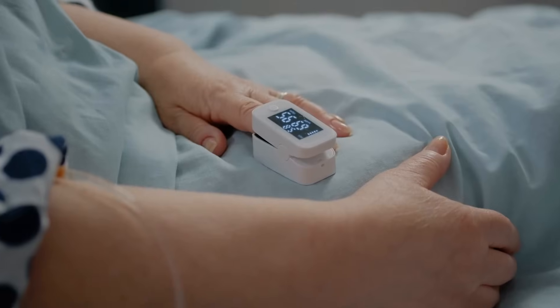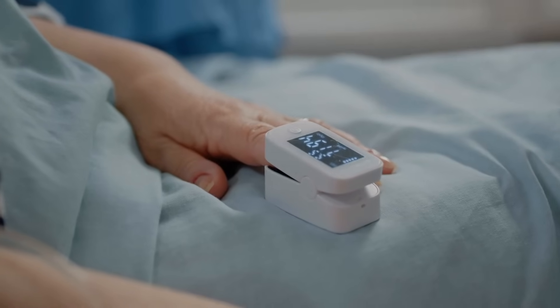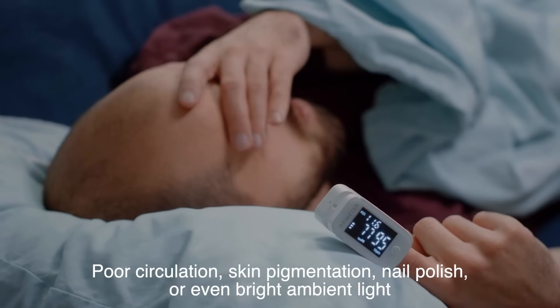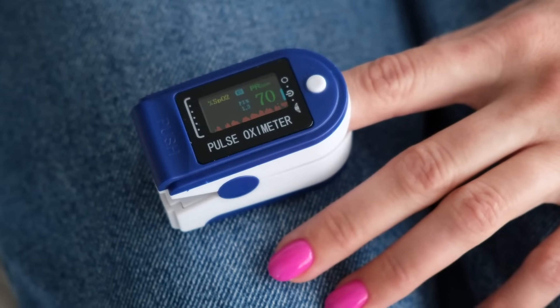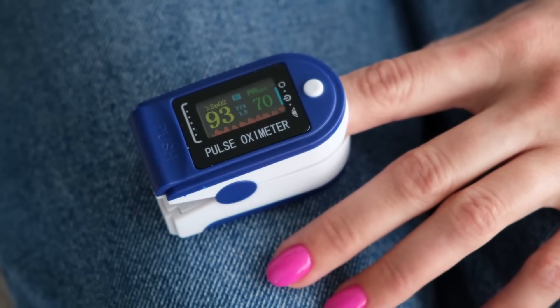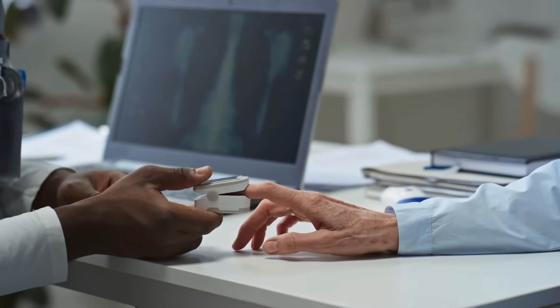While pulse oximeters are incredibly useful, they're not perfect. Their accuracy can be influenced by factors like poor circulation, skin pigmentation, nail polish, or even bright ambient light. For example, if your hands are cold or you're wearing dark nail polish, the device might struggle to get a clear reading. Similarly, they're not as reliable at very low oxygen levels, where other medical tests might be needed for confirmation.